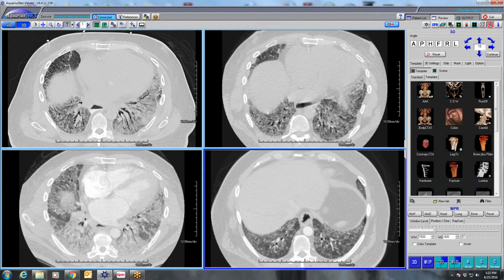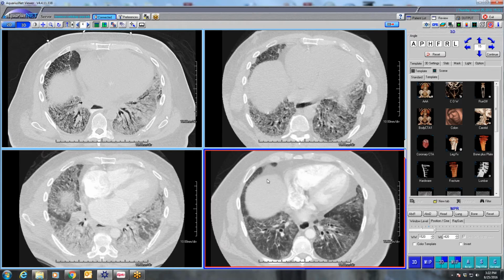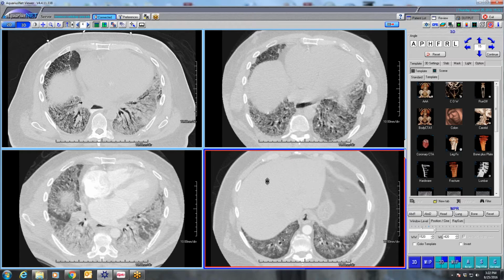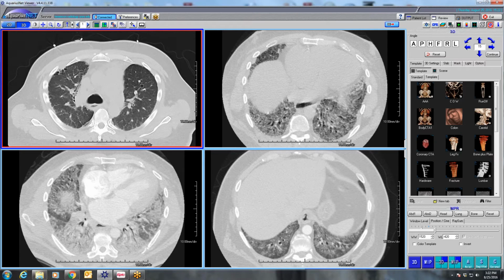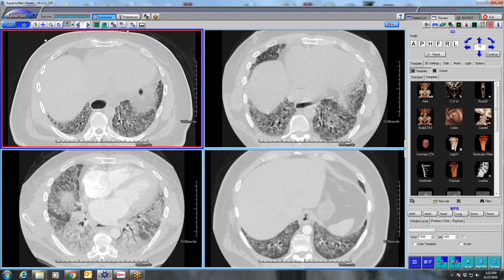So again, I'm a full believer that in a lot of these cases of NSIP, the initial injury is secondary to organizing pneumonia, which then, due to repeated injury, progresses. I have about 7 CTs on this guy showing it progress over time. I'm just showing you a few, progressing to fulminant NSIP. And again, now I have path on 2 sides on this case.